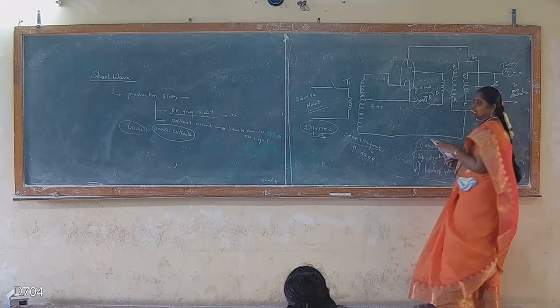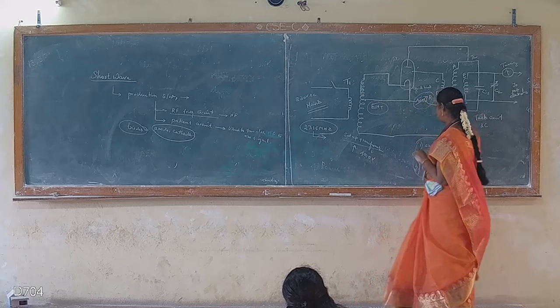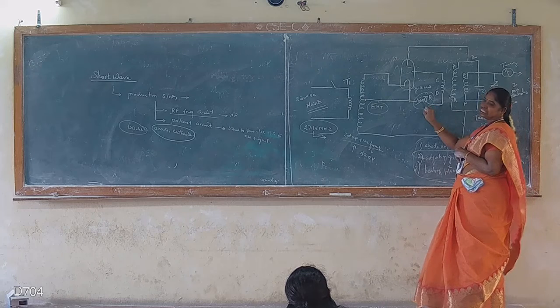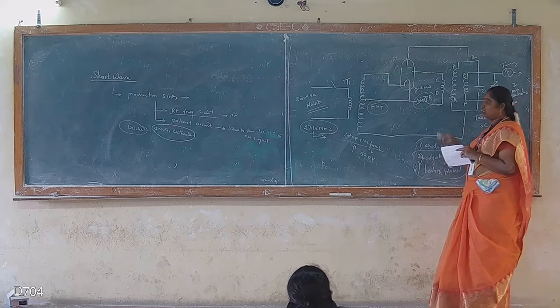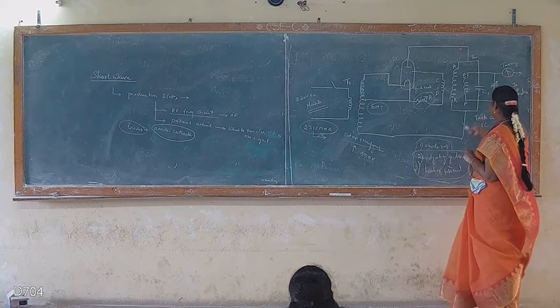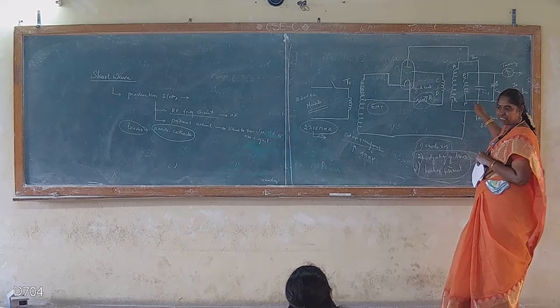Because it is a high-voltage unit and we are working with an EHT, adjusting the anode voltage and the heating filament is a little bit difficult. So just by adjusting the grid bias, we are able to control the amount of high frequency current. Here it is produced as a short wave. Apart from this, there is the tank circuit, which is an oscillator circuit.